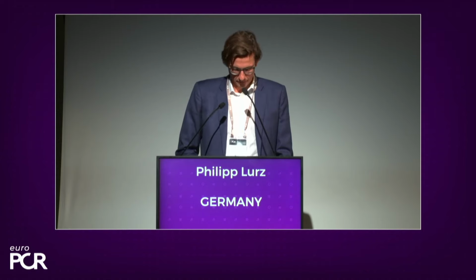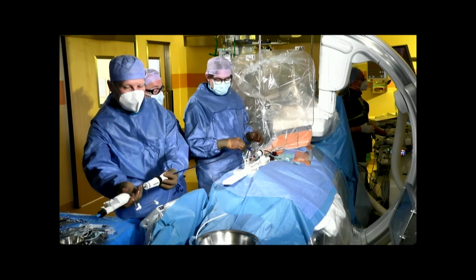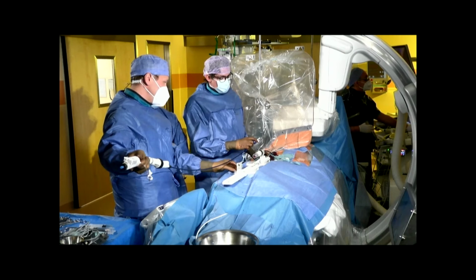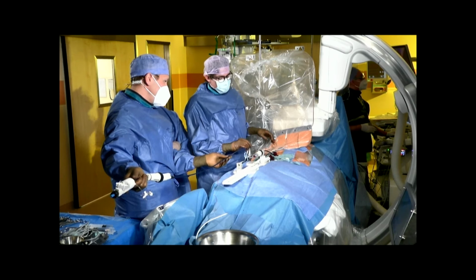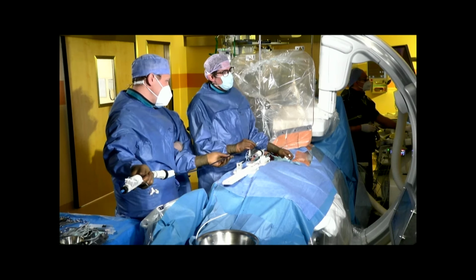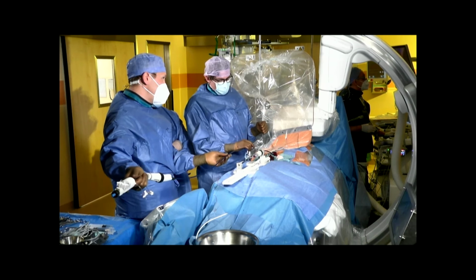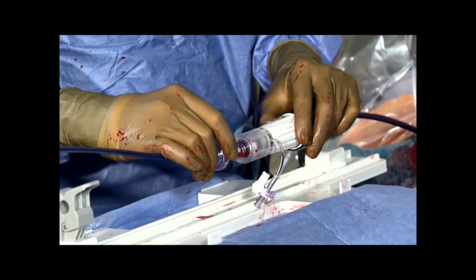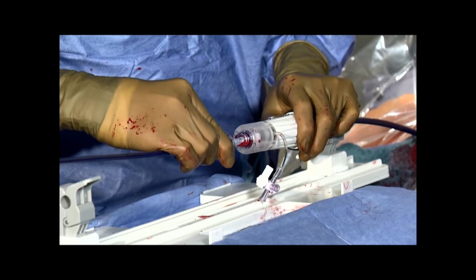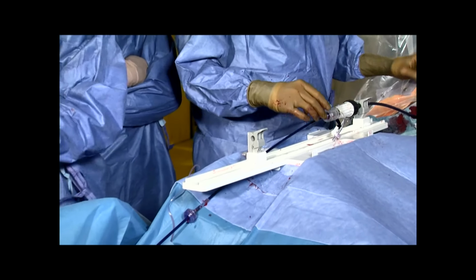So Philipp, why did you choose the ACE over the classic Pascal device? Yes, obviously the difference is the width of it, 10 compared to 6 millimeters. But the other difference is that with the ACE device, the spacer is a bit smaller, and I believe that has the implication that the two paddles come closer together. So in other words, I believe that the grasping force is higher with the Pascal ACE, and in a very dynamic environment like this one, I would like the leaflets to come together as closely and as firmly as possible, while preserving the leaflet and not causing any harm or injury.